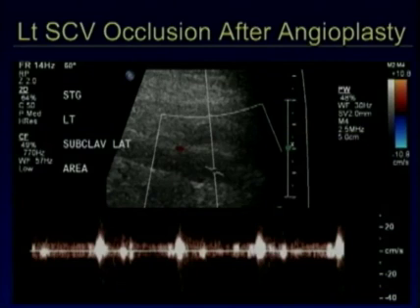And we, of course, verify that with a still image with Doppler on. The little bit of pulsation you see is from arterial pulsation.